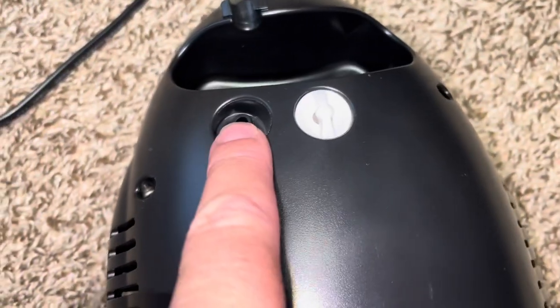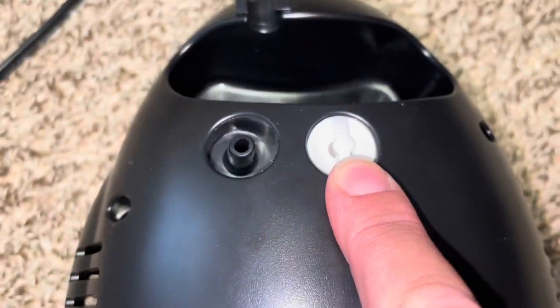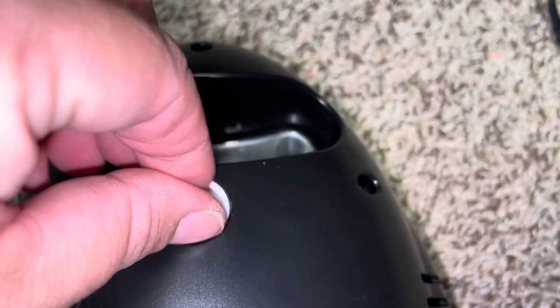You can see you can hold it here to carry it from room to room. Right here is where you plug in the tubing, and right here is an air filter — I'm going to show you both of those. Here's the on/off switch. Let me start with the air filter.